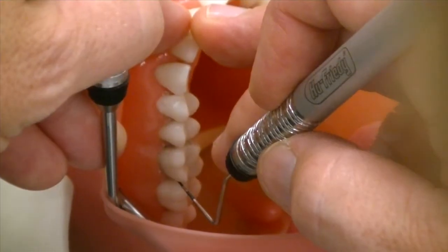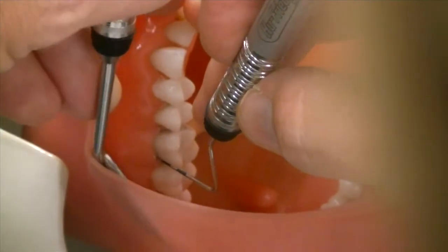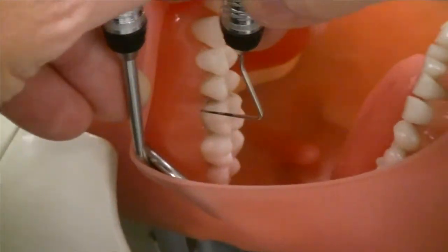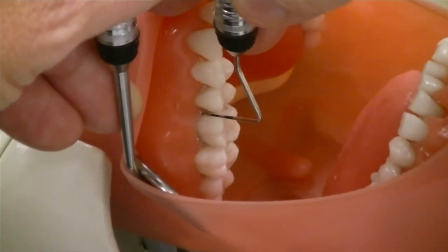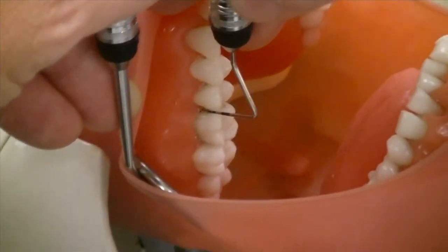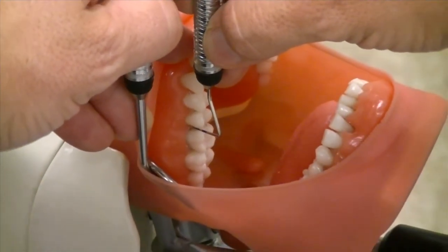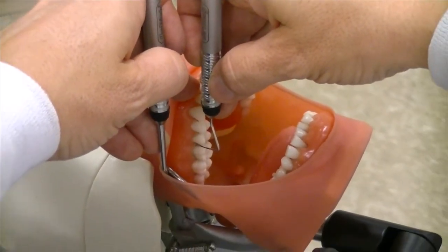Take your reading, take it out. Reinsert at the distal line angle, and it's important to pivot your hand up towards the mesial so you follow the probe along the side of the tooth. It's always in contact to the contact area, and then you're going to do two little bob strokes, angulating it interproximally, and then take it out.